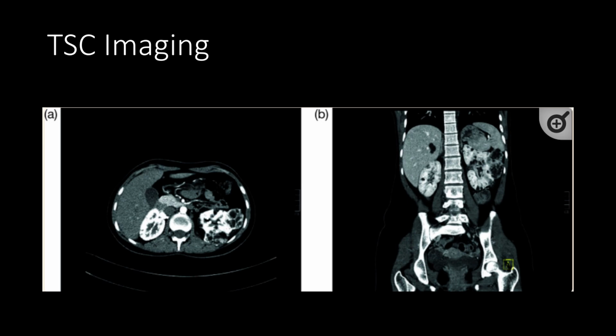This is an image of a patient with tuberous sclerosis complex, a CT abdomen pelvis with contrast in the axial view in image A and coronal view in image B. It shows a right partial nephrectomy and an enlarged left kidney with multiple angiomyolipomas, which are essentially fat attenuation masses that are seen growing from the lateral aspect of that left kidney. There are also multiple additional small angiomyolipomas and cysts bilaterally in both kidneys.